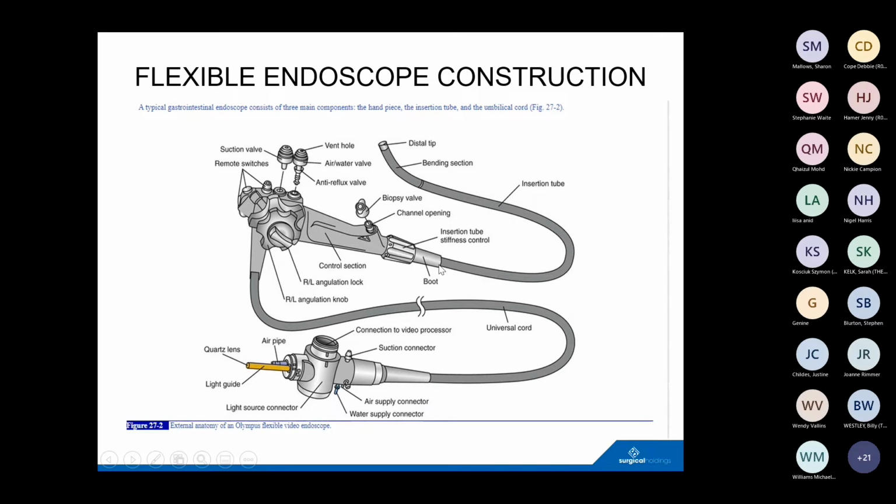And the insertion tube in many instruments is obviously very important in terms of the characteristics of that instrument. I remember, particularly with, for example, lower GI instruments for colonoscopy, an early colonoscopist I spoke to many years ago, we were talking about the improvements in optics, and he said it's not an issue massively, because if you haven't got the right insertion tube characteristics, you can't get that distal tip to where you want it to go. So the insertion characteristics are very important, as are the optical characteristics of the instrument.